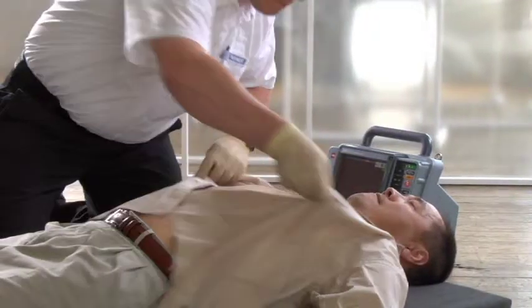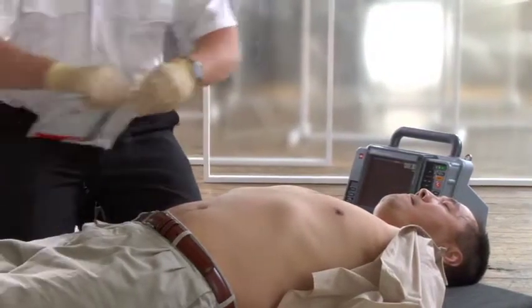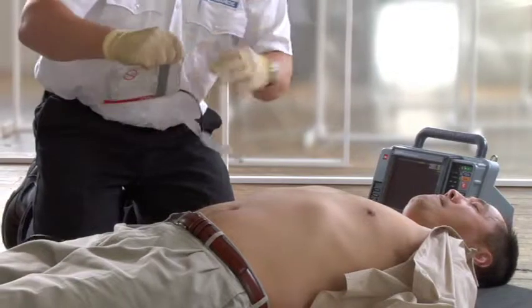Manual defibrillation. First, let me mention that the PhysioControl default configuration for the LIFEPAK 15 monitor defibrillator is to power on in manual mode. If your 15 has been set up to power on in AED mode, access to manual mode might be conditional. It's important that you are familiar with how your defibrillator is set up and how to access manual mode on it. Okay, the 15 is on, we're in manual mode, and we have confirmed that the patient is in cardiac arrest.